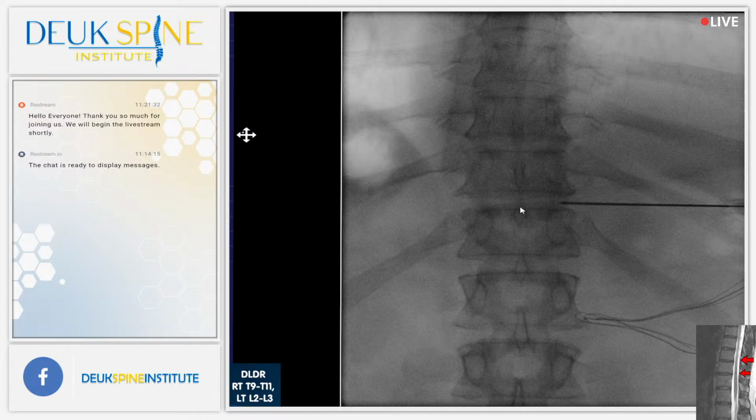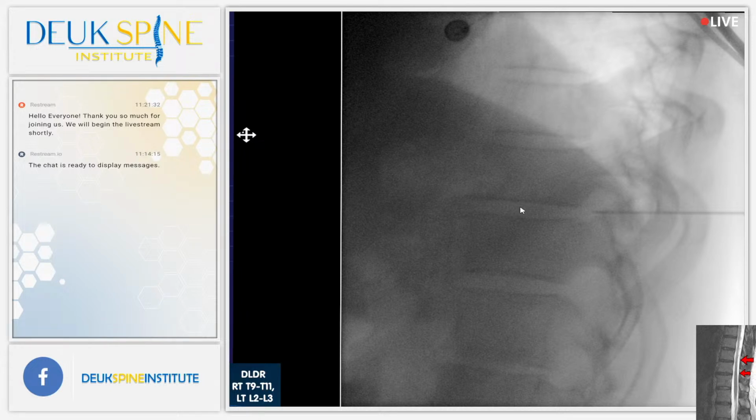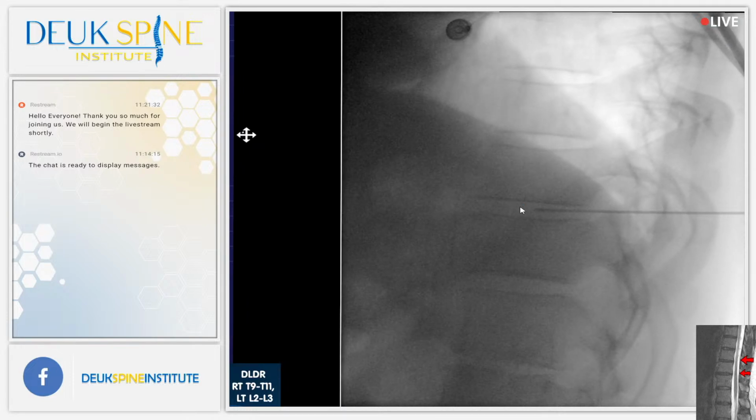Okay, Henry, are we live, by the way? Yes, we are. All right. You can see the needle is at the mid-pedicular line. This patient has huge discs. We're going to use a larger scope to do his surgery. All right. So we're just about done here. I'm just placing this shot into the disc, and then we're going to do the next one. Shot. Now I feel a tear, by the way, a huge tear. AP, we're going to do an AP view. You getting all these views, Henry? Yes, sir. Perfect.